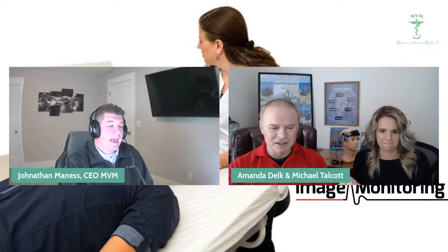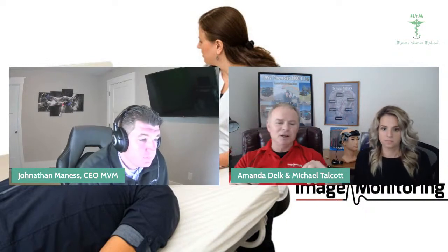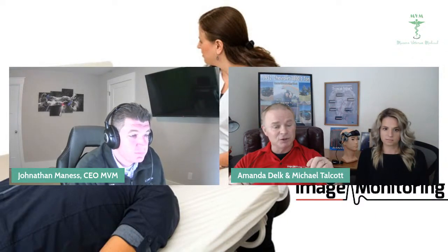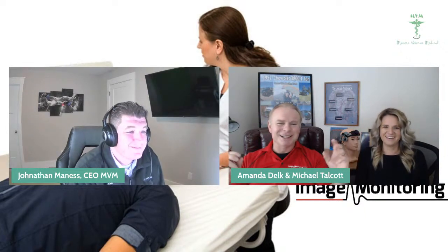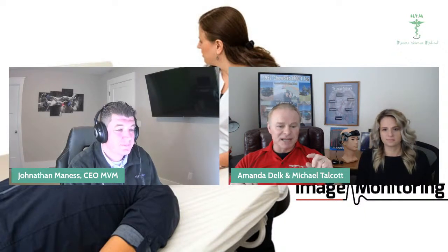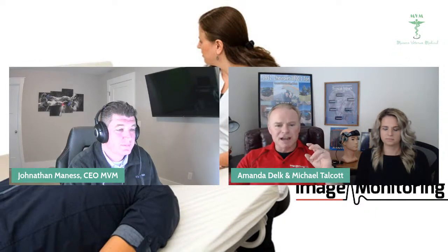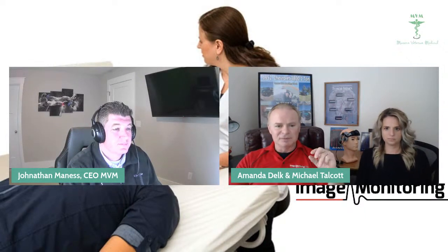Outstanding. And again, one more time, how long does the test run normally when you're doing it? Yep, a study can run anywhere from 15 minutes, 5 to 10. Actually, 5 minutes is the shortest that we would do. Like if you're doing a breath holding, unless you have a person that's a professional diver and can hold it for 15. But typically, a breath holding study is 5 minutes. A monitoring study is 20 minutes. A PFO study is about 15 minutes. A typical diagnostic exam, when we're using the probe at various spots around the cranium, can take about 25 minutes because we're interrogating every vessel in the brain and telling you what's going on there.